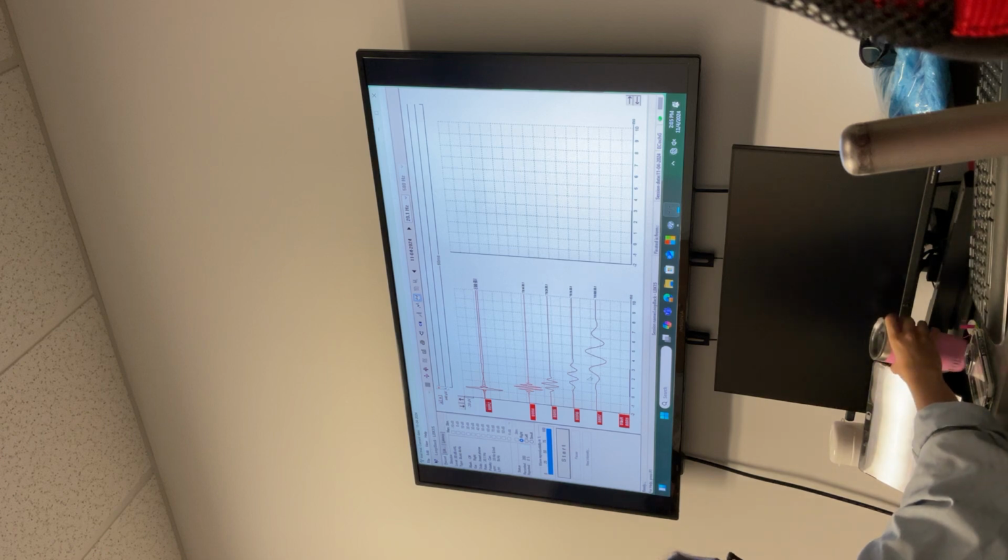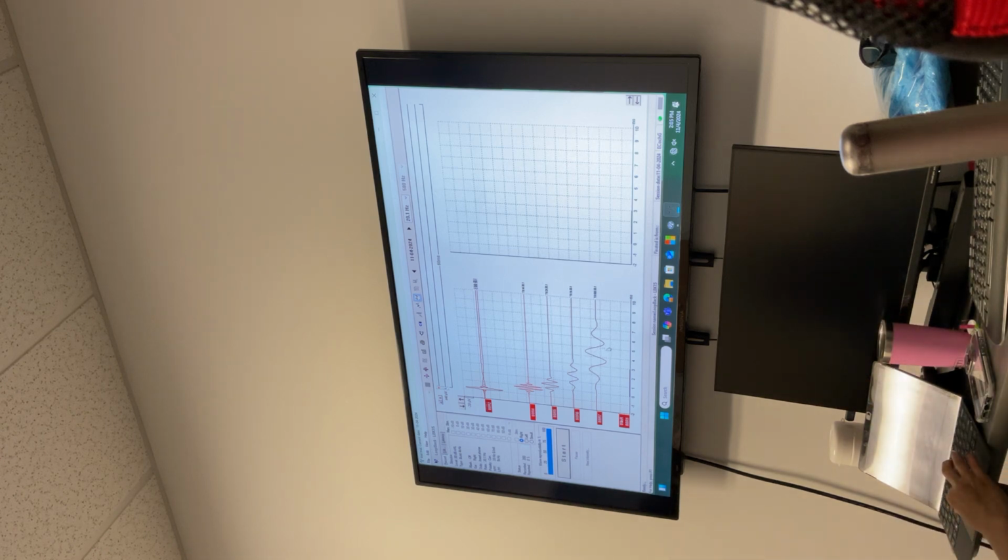Again, at 500 hertz, you're struggling to see the response. The main reason is the nature of the stimulus. The stimulus is not ideal for an ABR, but for 500 hertz at a longer period, there's very slow rise of energy. You have to do your best. Just blame it on the stimulus. If it was a click like this, see it's just going on and off. That's ideal for ABR. Even 4,000 hertz is going up really quick. 2,000 hertz quick. 1,000 hertz is taking so much time here.